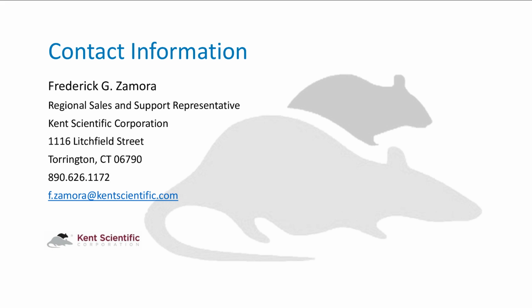Oh, yes. So we did do in-house dosimeter studies for that. Basically, with the Somno systems, the isoflurane was undetectable. So again, I could send you that chart that shows all the different graphs for that as well.